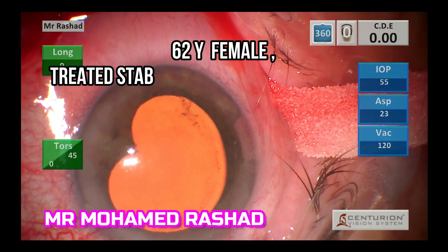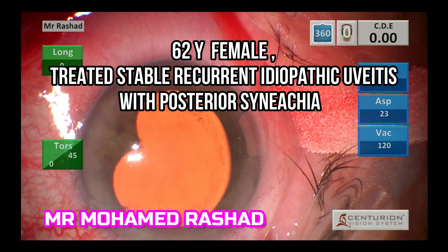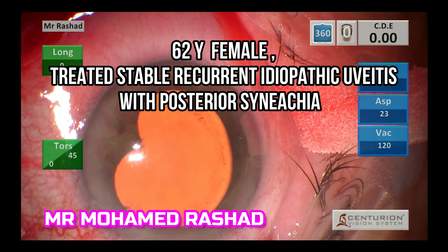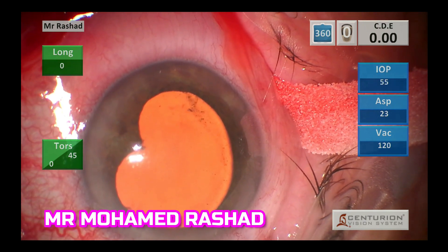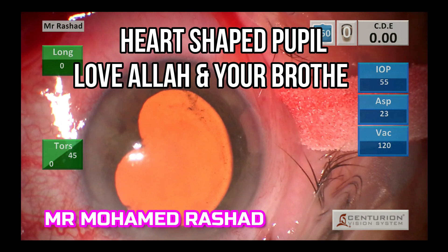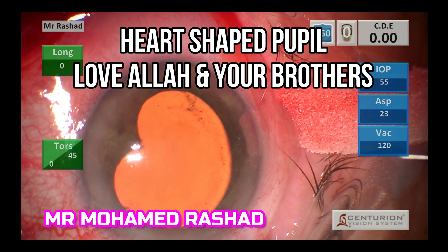This is a 62-year-old female with stable recurrent uveitis with posterior synechia and complicated cataract. The synechia is making the pupil heart-shaped, and this is reminding me of continuous loving of Allah and your brothers.